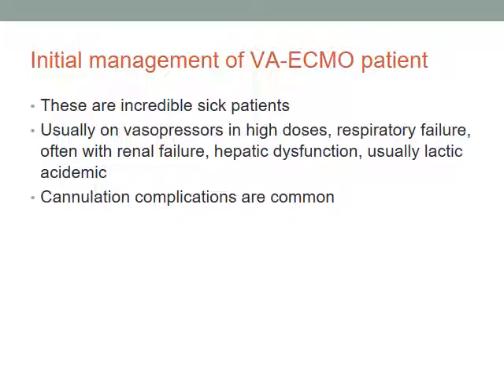But the majority of these people smoke, they've got lung disease, they have vascular disease, they have diabetes, they have something, and cannulation complications are common. These are challenging. You have atherosclerotic disease, somebody in an emergency situation tries to cram a 21 French cannula up your leg, there are all sorts of issues. By the way, another thing kind of beyond the scope of the talk is leg perfusion strategies. There's just a lot of stuff in ECMO, but this is just skimming the surface.